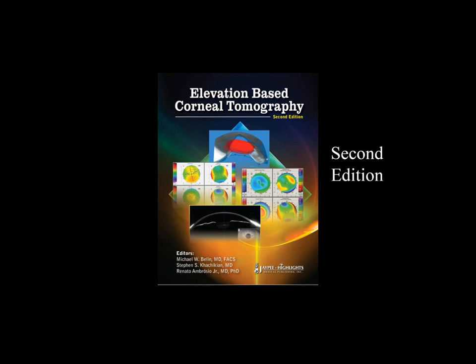It's not something I routinely do, I don't do routine cataract surgery, so I'm probably the wrong person to ask that. But if you look at those tracings, you will see, and you can actually follow a progression of lens changes. The problem is that you've got to make sure you're on the same orientation. I don't know if there's a global reading yet on the Pentacam for lens clarity. That I really can't answer.